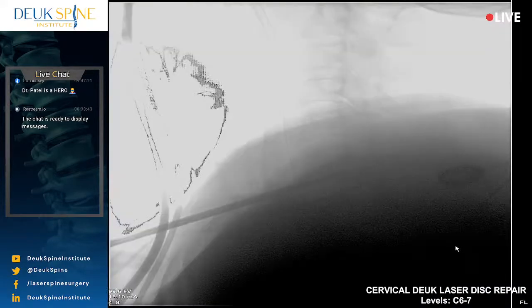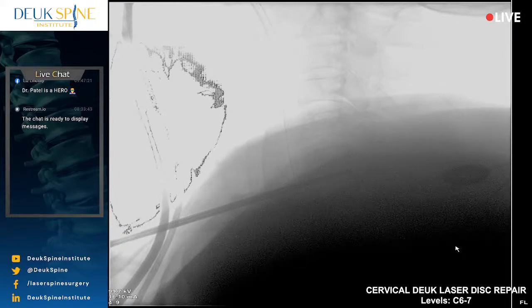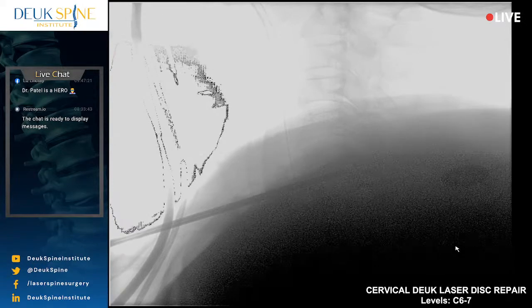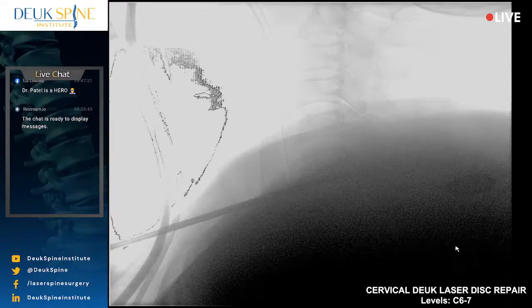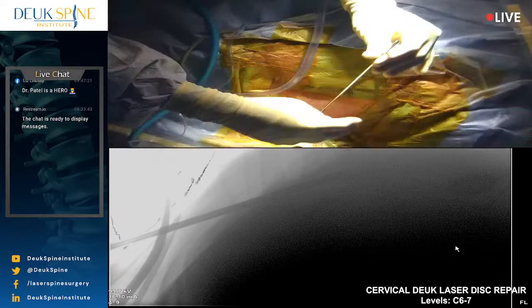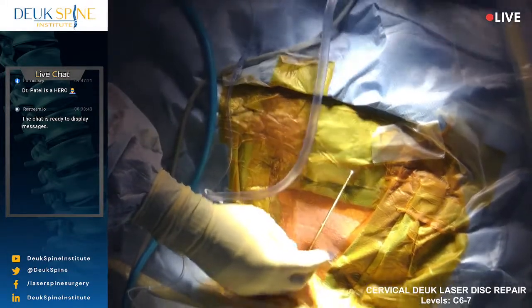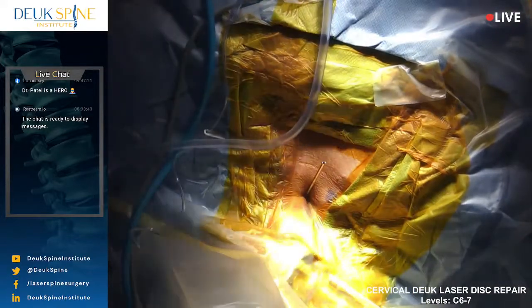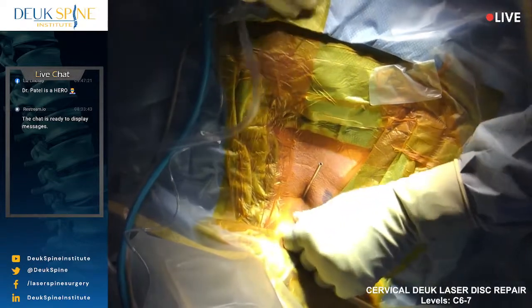Shot. You watch the tip, Luis, make sure it doesn't advance. Shot. Shot. Shot. Pretty much there. That's good. All right, so we're where we need to be with the tube. I know it's hard for you all to see that. That's going to be hard to get out. Good job, Luis.